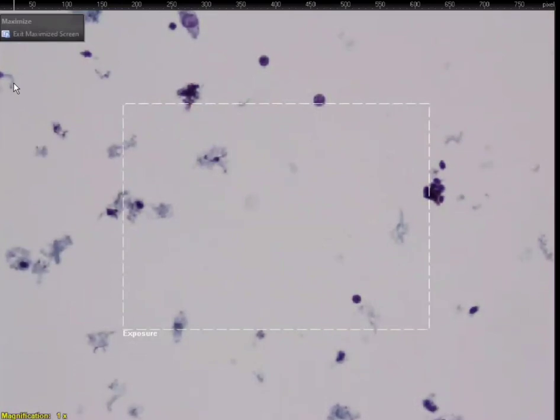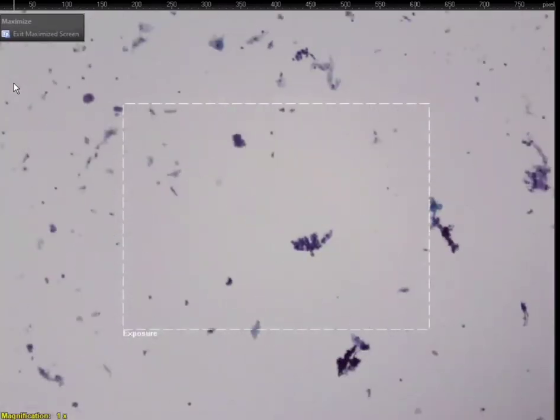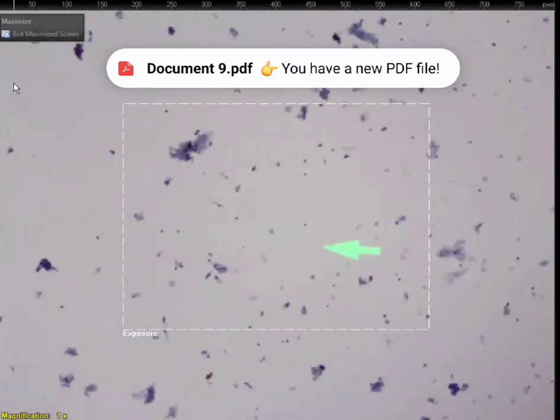Not too many lymphocytes. Okay. All right, let's look around and see what we have here. So there is a lot of this distracting epithelium, respiratory epithelium. Yes. It's very distracting. Not a good sample. Not a good lymphoid sample anyways.